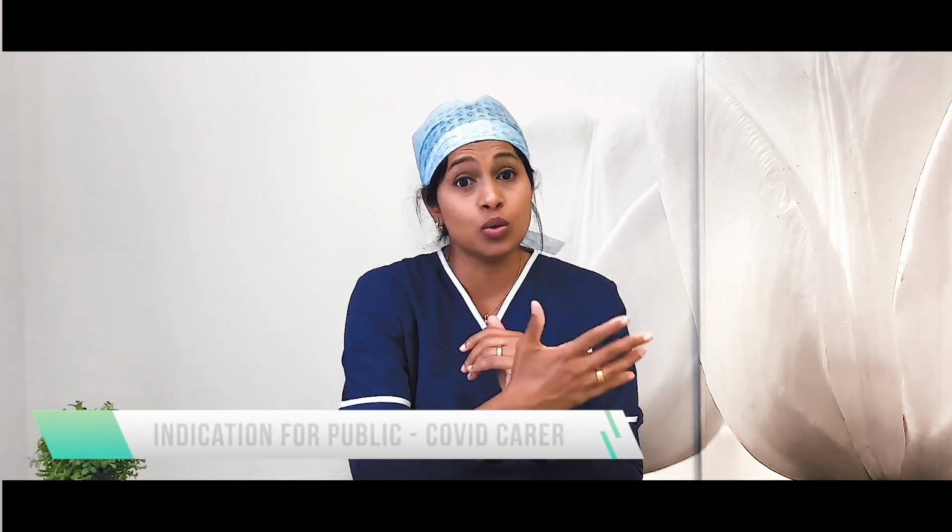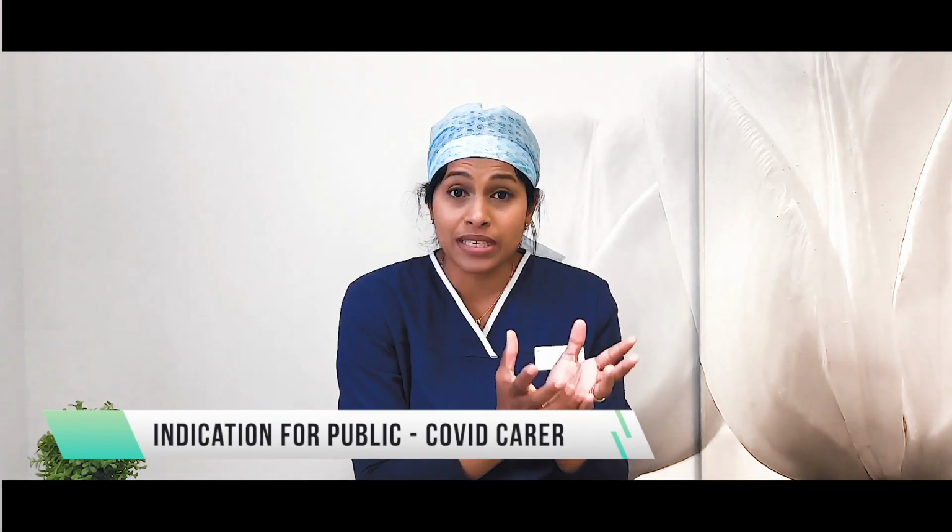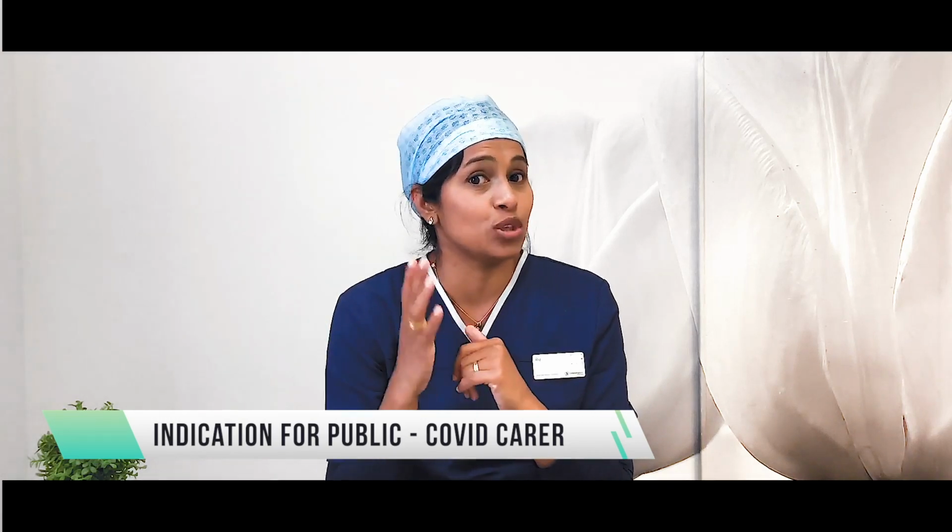The N95s and all that, you really don't need, because it is only if you're in close contact with a person who is infected. If you are looking after somebody who's got COVID-19, that may be a time that you can use your respirator.